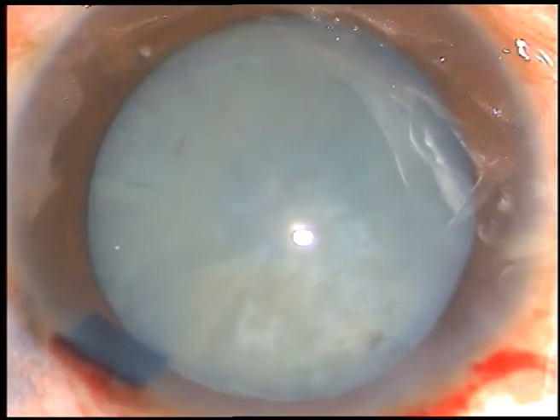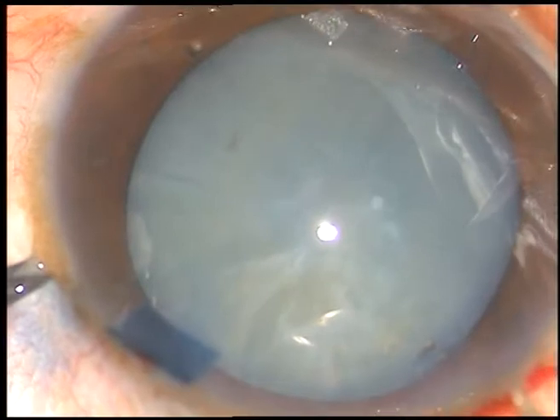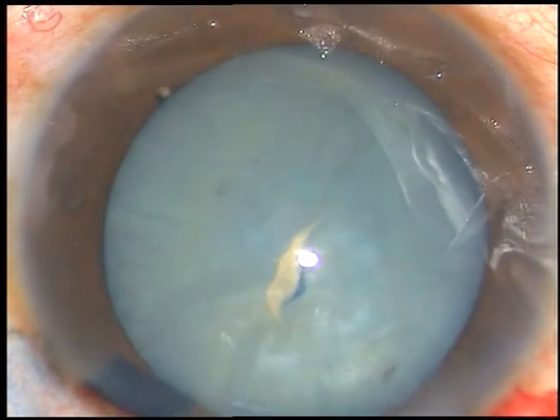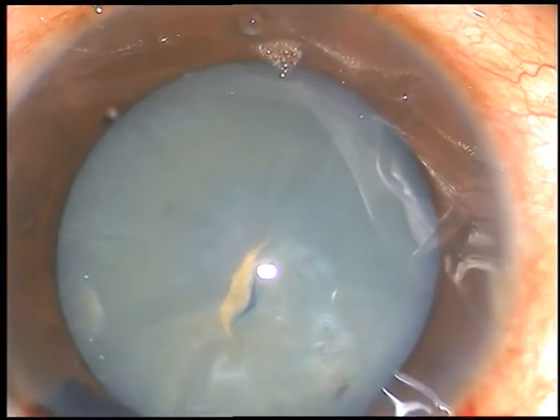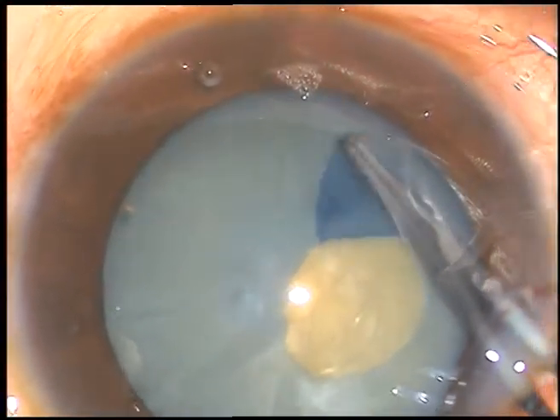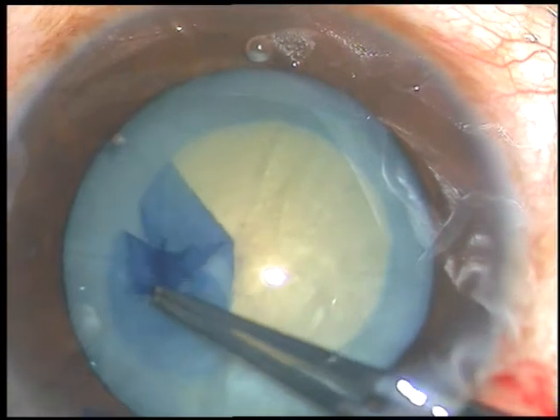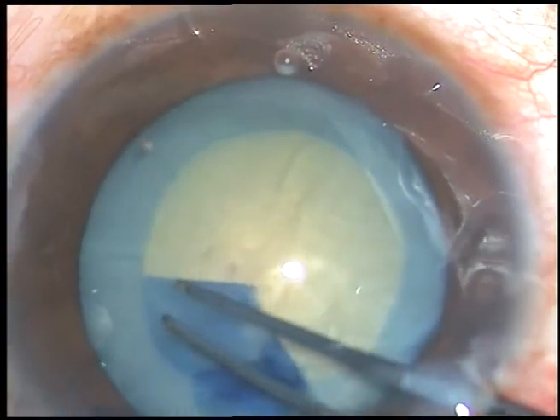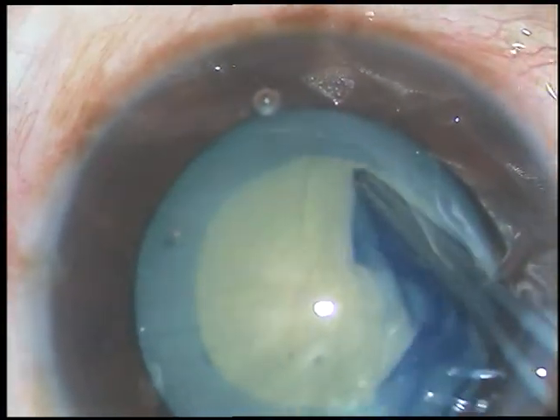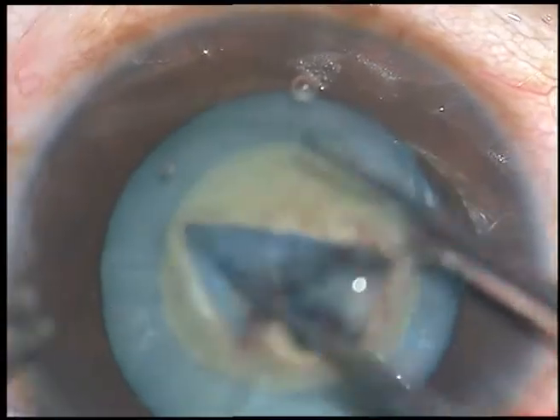Now I want to incise the anterior capsule with a 26 gauge bent needle. Now I use Utrata forceps to hold this capsular tag, go anticlockwise and do a CCC. This rhexis has become about 4 millimeter or 4.5 millimeter.